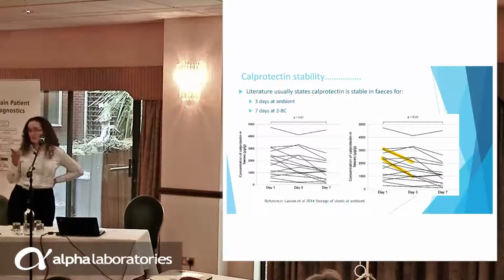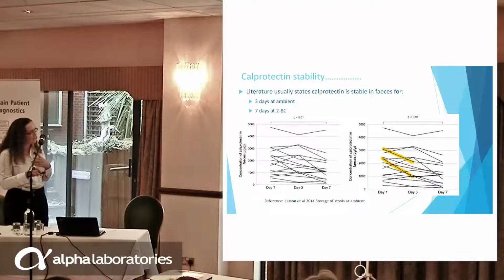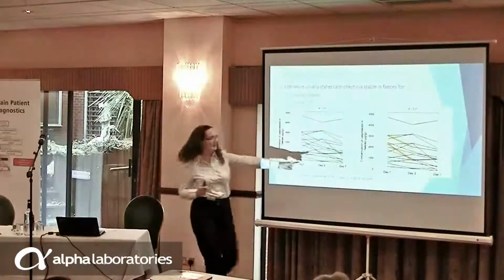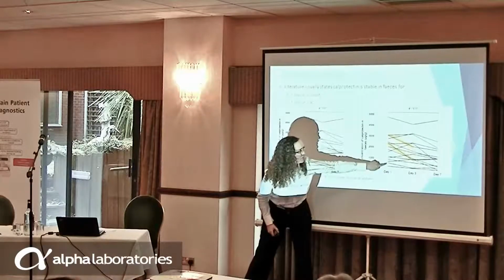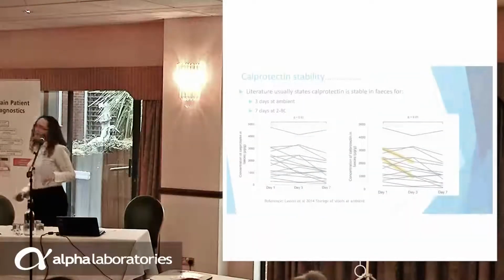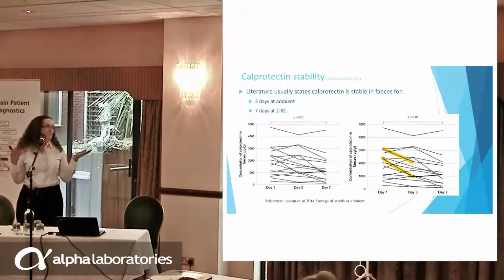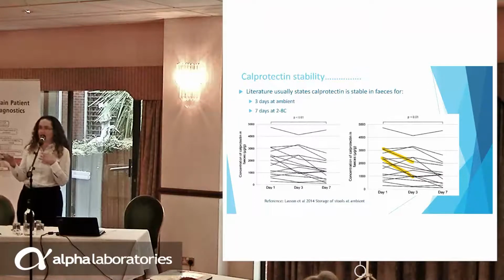And unless you're monitoring, you might just say, well, it was positive, it was positive, it was positive. But if you look at this sample here, I'm shaking, I'm going to do it with my finger. This one here starts off at around 500, and it goes down to, maybe, a couple of hundred? Not quite sure really. I mean, 500 is probably, not trying to take away the thunder, a figure that you might act upon as a gastroenterologist.